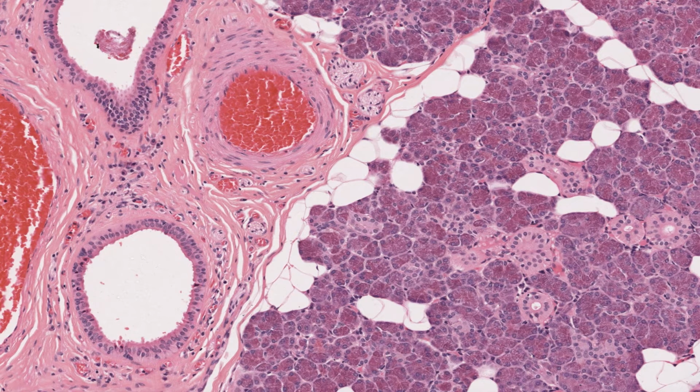Let me explain to you the duct system of this gland. Ducts are named in two ways, by location and by function. Thus, locationally, as I can show you in this image, the ducts of the parotid gland may be interlobular, such as this large one here, and don't confuse it with this small artery, or intralobular, such as this one here, and here, and again, these two over here.